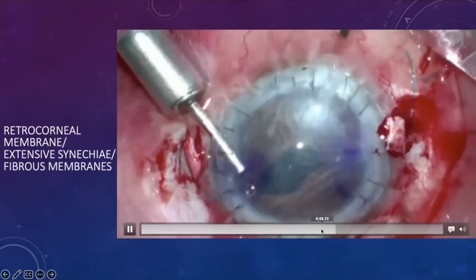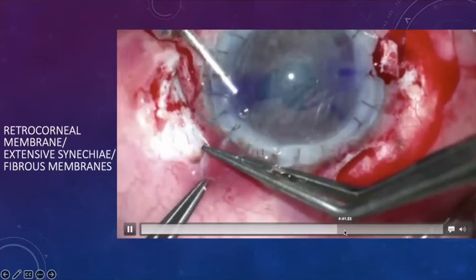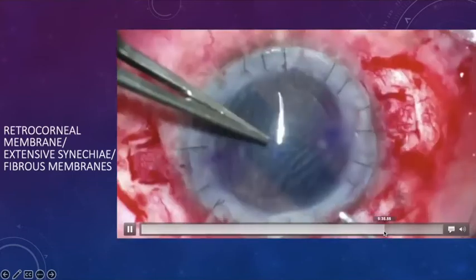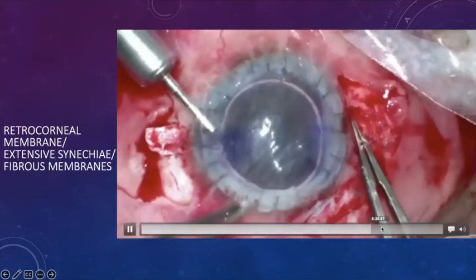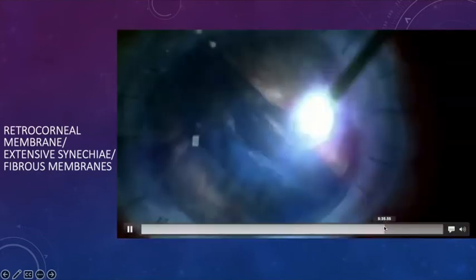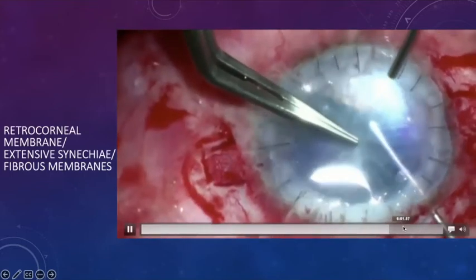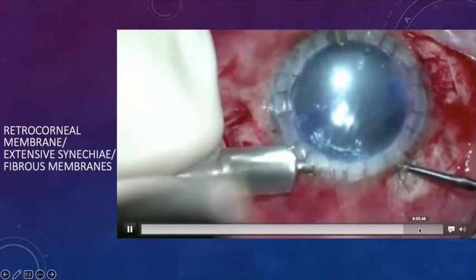We put in a glued intraocular lens. You can see the haptics are already out. Now we're doing a pupilloplasty, making that pupil rounder because you want to get a good air support. Check our air support by putting in an air bubble. So that's a stable air support to close the flaps of the glued IOL, and use the air pump assisted technique to open the graft up.